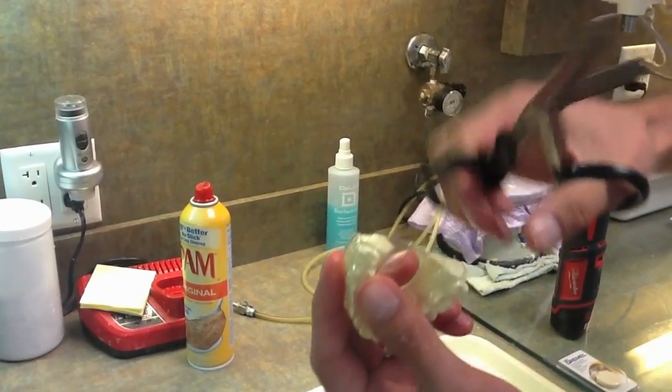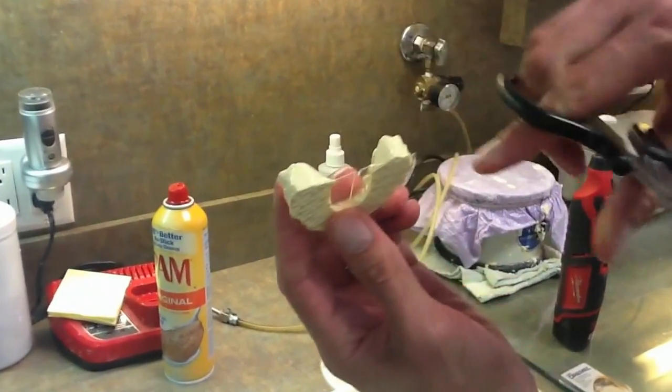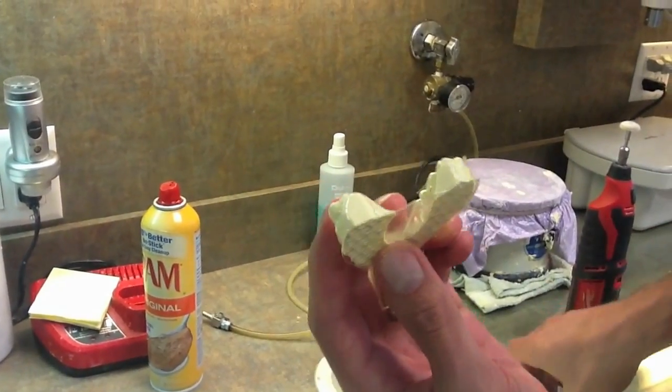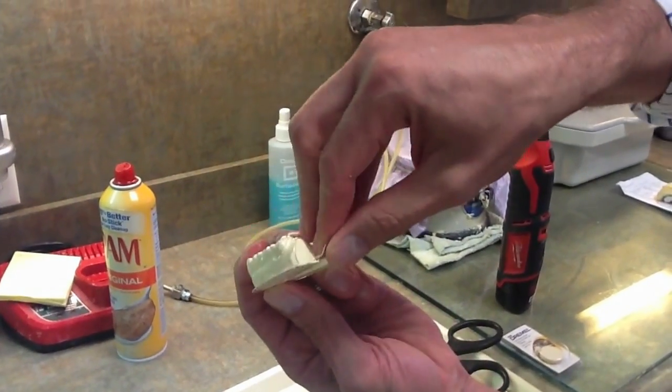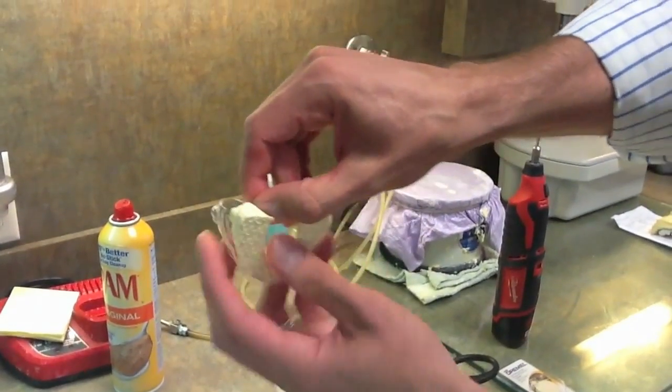The nice thing about the scissors is that they can cut the model as well. You can see I've cut areas away of the tray, and now we're going to try — I just grab this here, flex it, and it should allow you to just pop it right off.